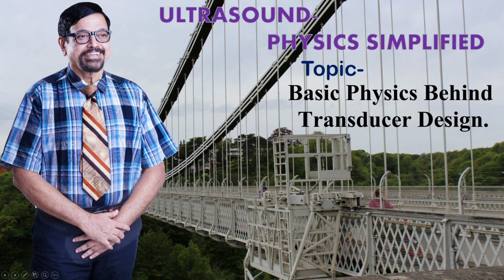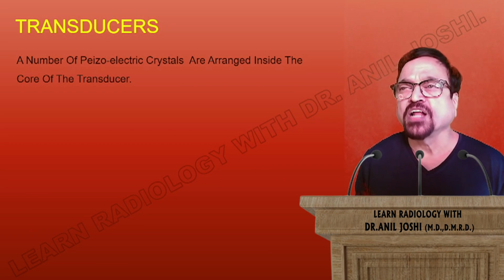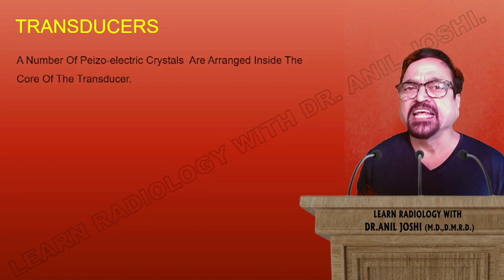Now with that brief introduction, we are starting our lecture on ultrasound physics pertaining to the physics behind transducer designs. Now let's come to the detail. What is a transducer? The transducer is a device which an ultrasonographer, an ultrasound doctor, holds in his hand and keeps on the patient's organ of interest for study. But there is a lot of physics involved behind the designing of this transducer, which we are going to see in this lecture.